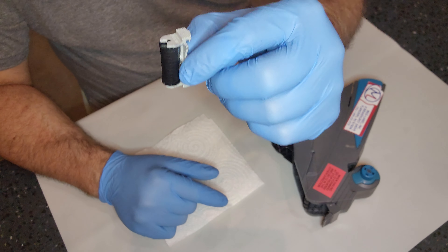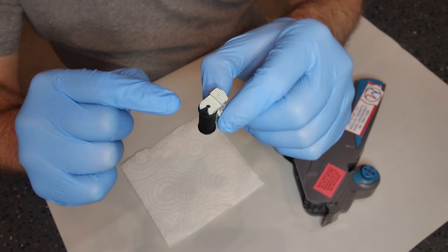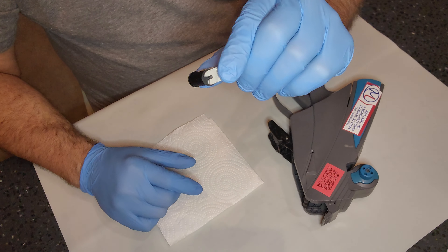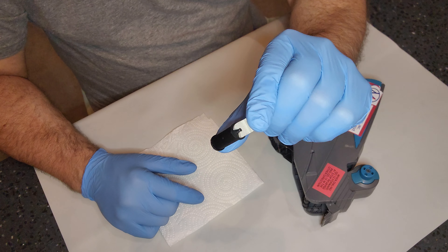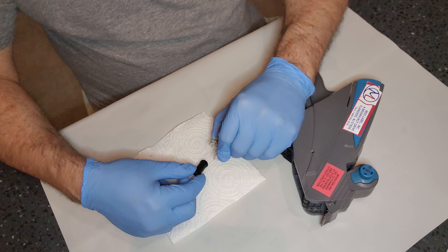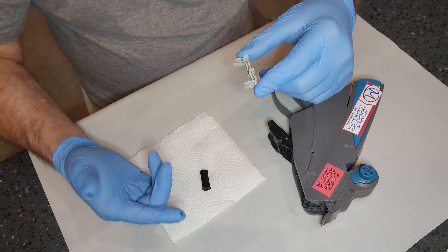With your gloved hand, slide the ink roll out — this is the actual ink roll. The only thing you're going to dispose of is the ink roll itself, not the housing. Pinch the sides so that the ink roll opens up, and you can pull that ink roll right out.